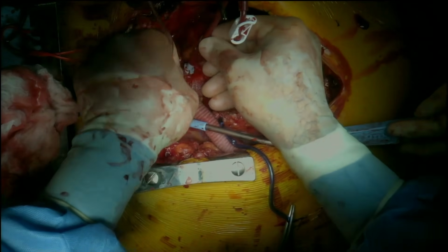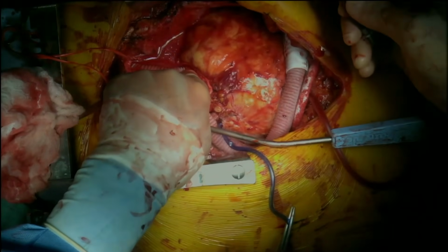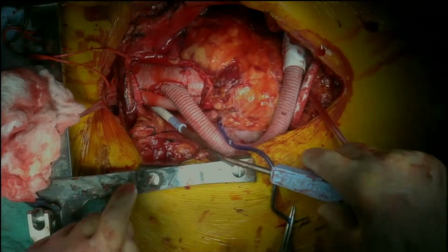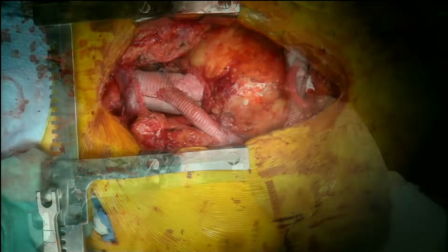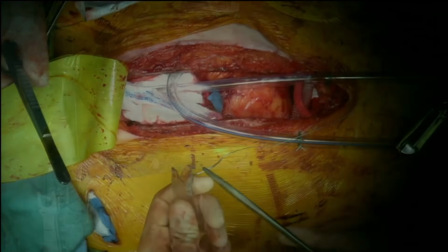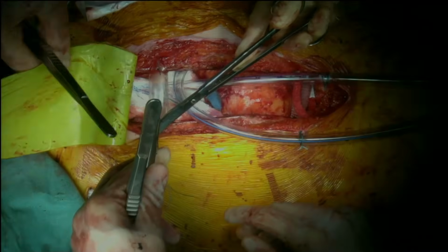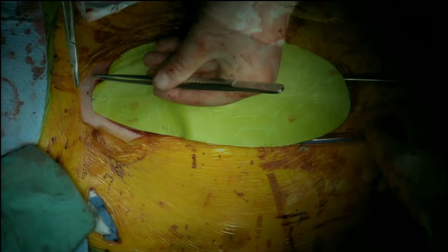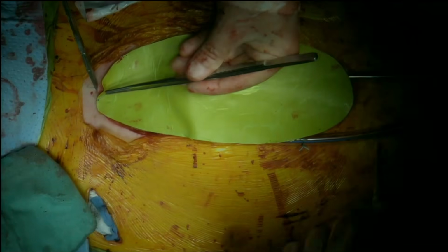Following the de-airing, LVAD support is initiated and the patient is weaned from cardiopulmonary bypass. Given the complexity of the case, the chest is selectively left open for delayed closure using a Gore-Tex membrane.